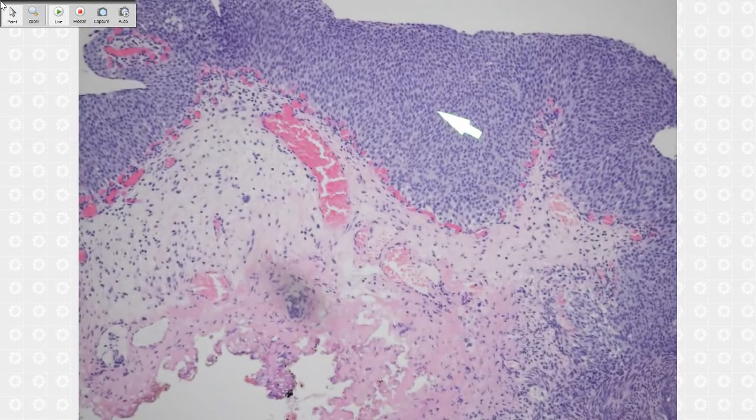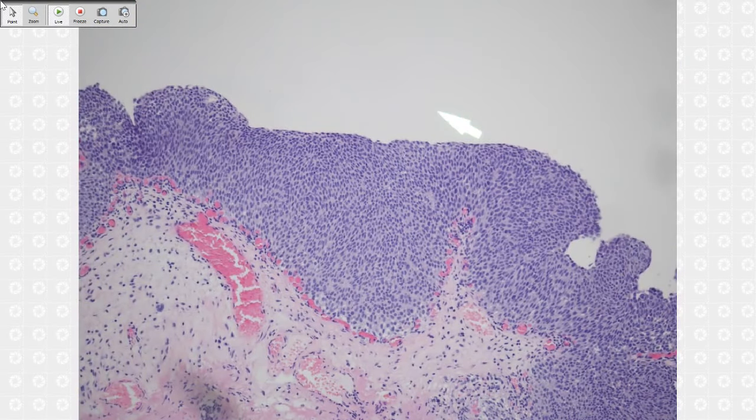In another area you see this very thickened urothelial mucosa. I just want to show you what kind of scenario you call this UPUMP, because urothelial is a flat lesion. First thing, if it's a papillary lesion, go to PUNLMP, right? If it's a flat lesion, UPUMP means urothelial proliferation of uncertain malignant potential. Usually when you see thickened urothelium like this, it's minimal, right?